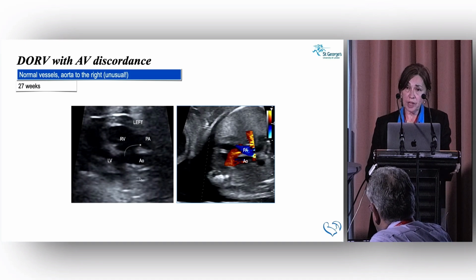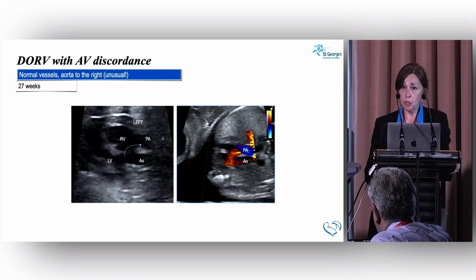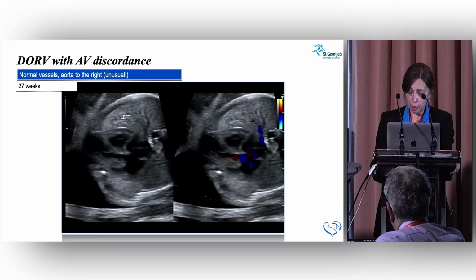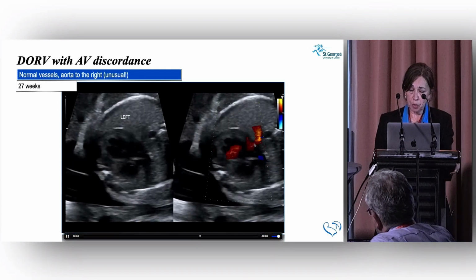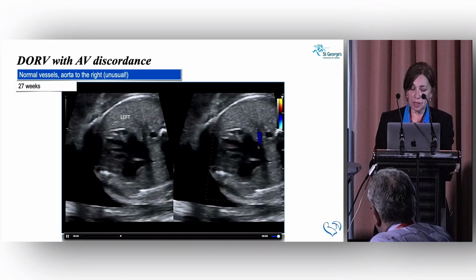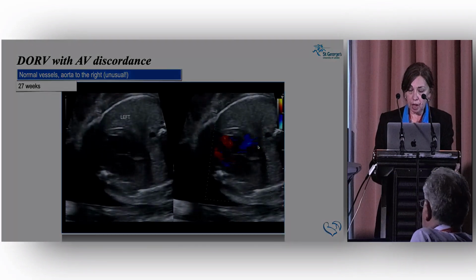So blood that comes here from the right atrium is desaturated, or less oxygenated, into the left ventricle, through the VSD, into the pulmonary artery preferentially. So this is working like congenitally corrected transposition. Although this is a very complex case, this baby is expected to be a bit cyanosed at birth, but well and stable. And this is the clip that demonstrates that. Flow through the VSD, and you can see here the branch pulmonary arteries coming up. The flow goes preferentially into the pulmonary artery. So despite all of the complicated factors, this baby is expected to be well shortly after birth, and then we have to deal with the problem afterwards.